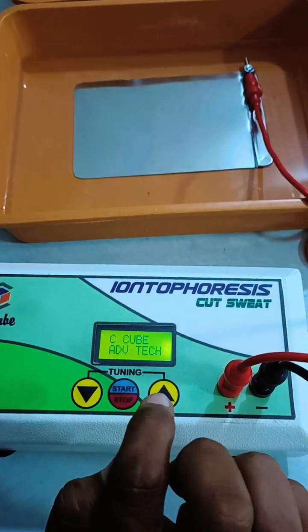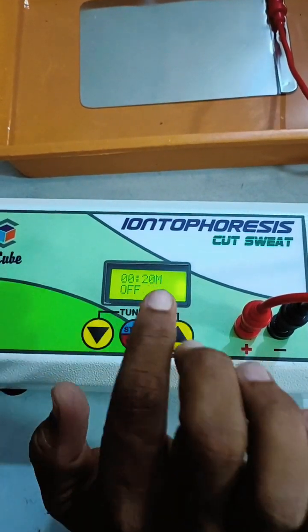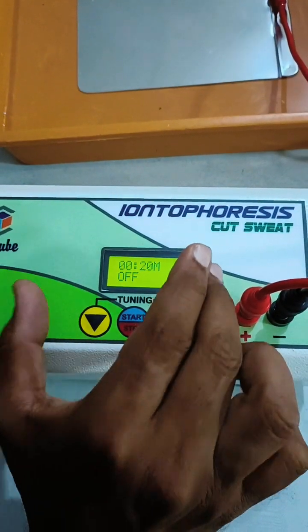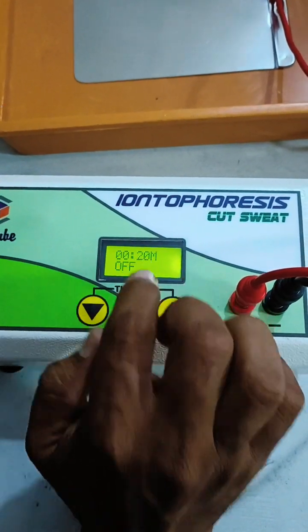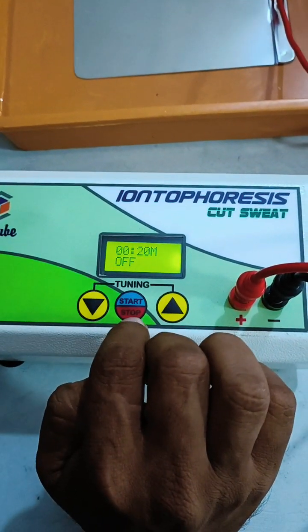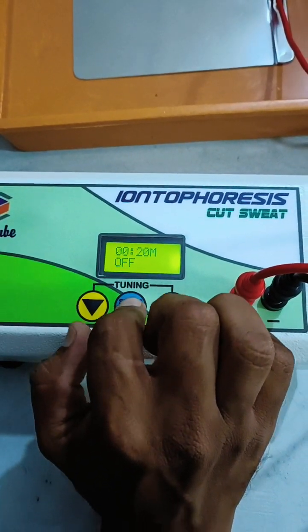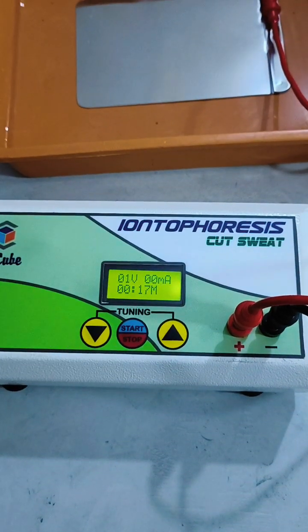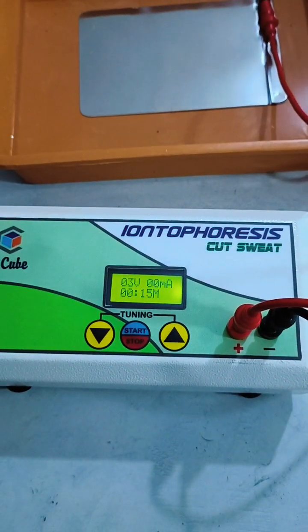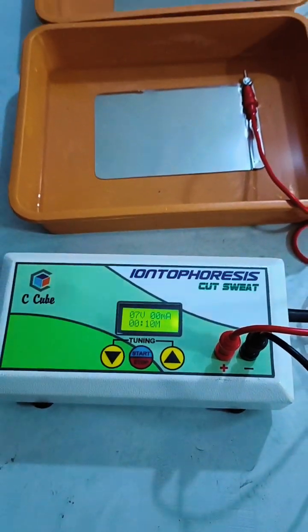From the next time you use this device, the tuning function is not required, because the required current, voltage, and treatment time are already stored in the device memory. Simply insert your hands into the tray with the electrodes, press start, place your hand within 5 to 8 seconds, and you are ready for the next treatment.